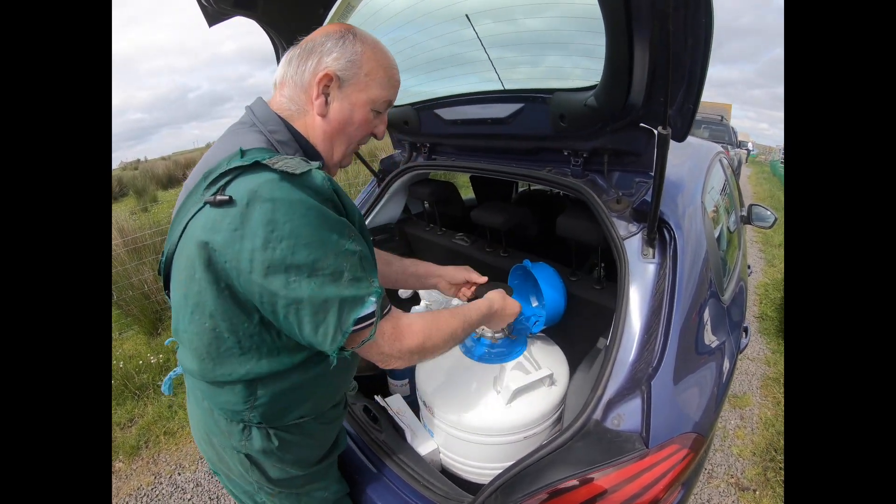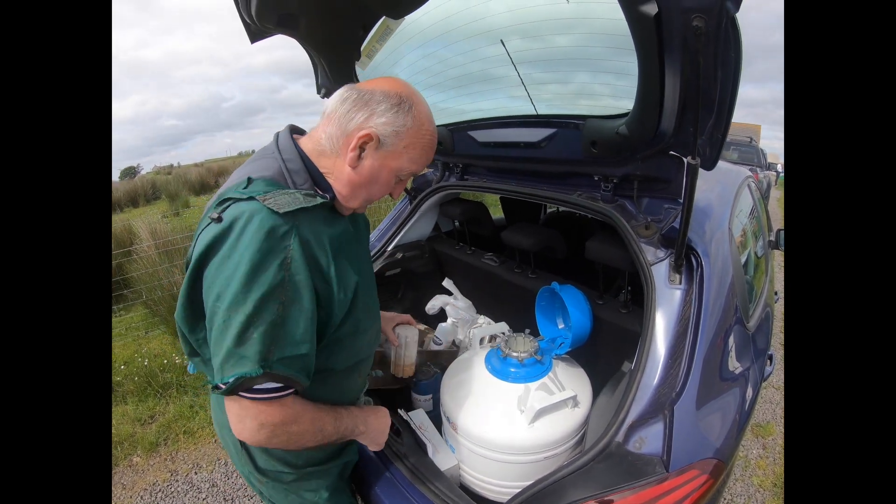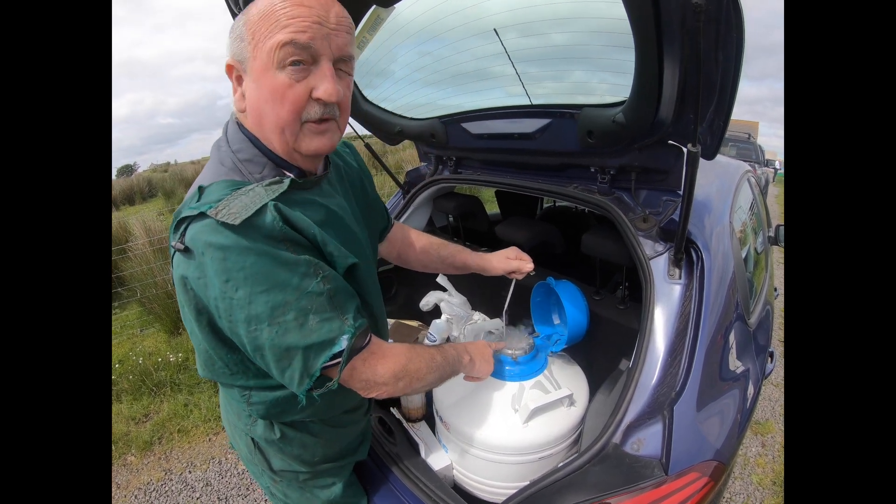Well, here we are. This is a container full of bull semen stored frozen in liquid nitrogen, which keeps it frozen at a temperature of 192 below zero.